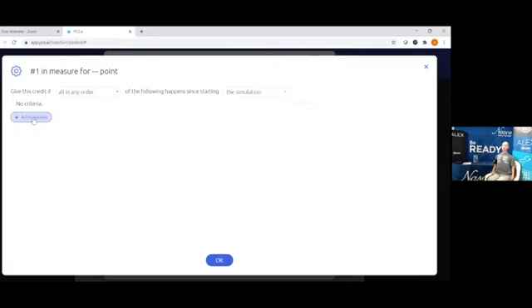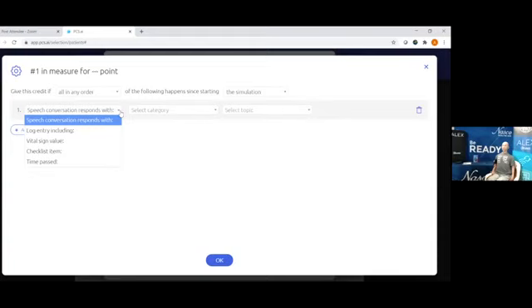By adding criteria, you can set your criteria based on the log entry. Maybe if you want it to be specific to blood pressure, or heart sounds. Listen to heart sounds, listen to lung sounds are two of the choices you can utilize, so that when you auscultate, they'll get credit for doing that. So you would do log entry. If the vital signs, maybe you make a change in there, or a checklist item, or how much time has passed, are all ways you can set that criteria in here.